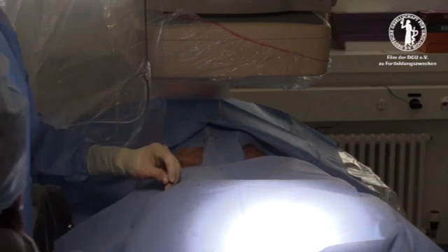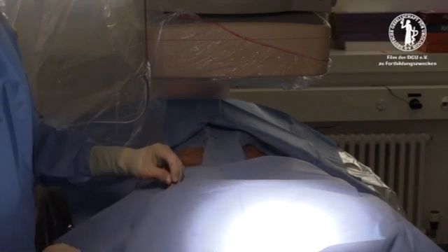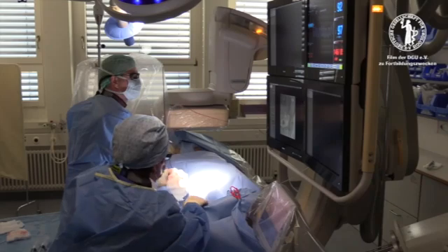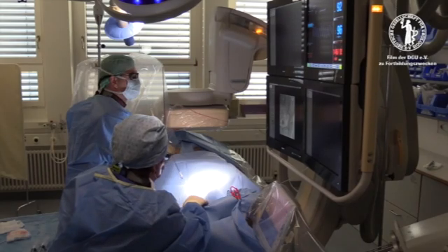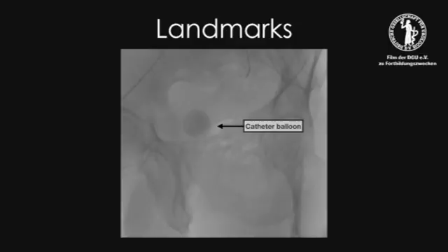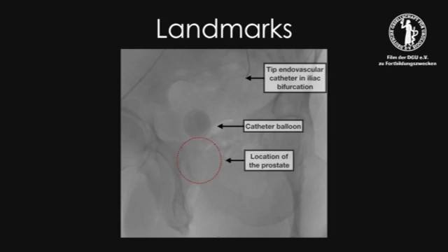With a four-French omniflush catheter, the aortic bifurcation can be crossed over from the right side to the left. Helpful landmarks are the balloon of the transurethral catheter and the tip of the endovascular catheter in the iliac bifurcation. The supposed location of the prostate is shown by the red circle.